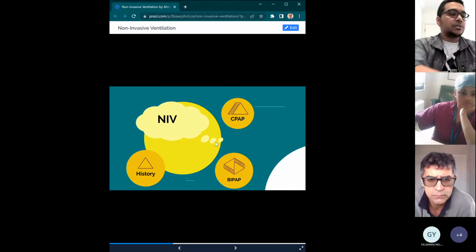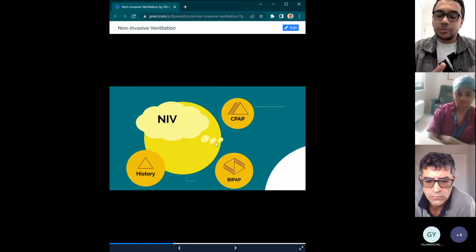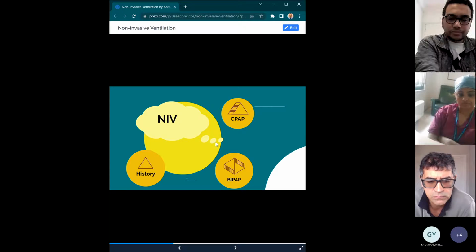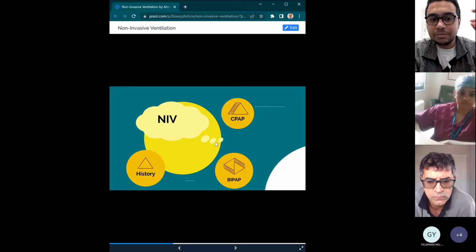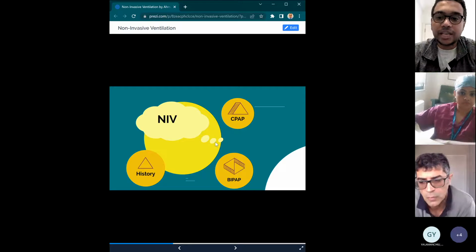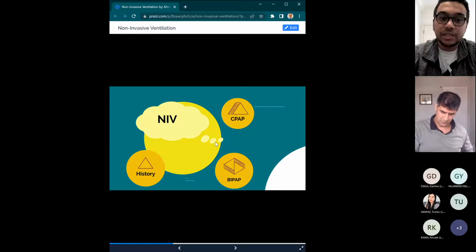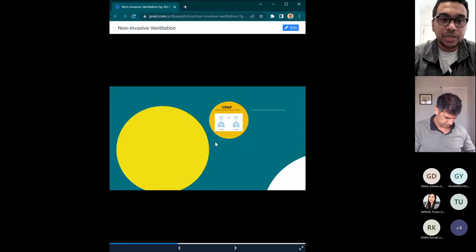We have two modes of NIV. Usually when we say NIV, people subconsciously mean the BiPAP, which is the two-level pressure, but actually NIV is the CPAP part, which we'll talk about in a minute, and the BiPAP part, which we will also talk about.